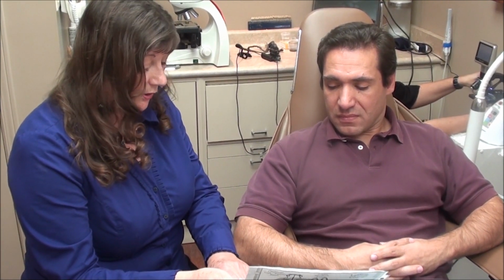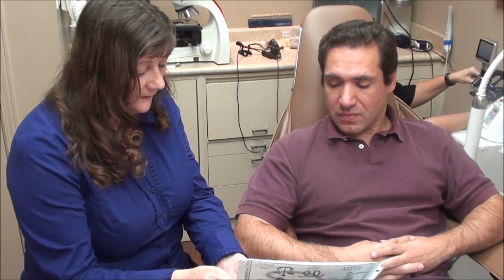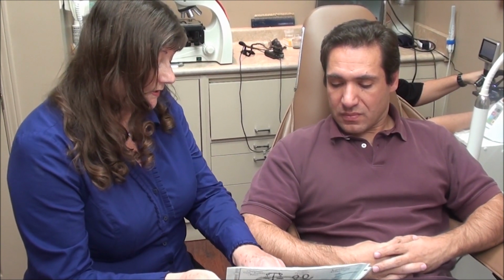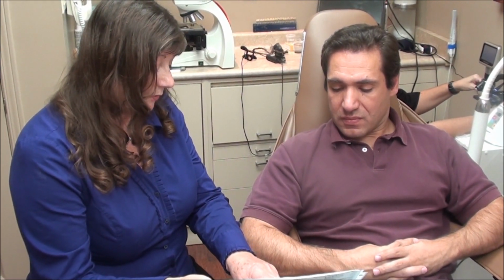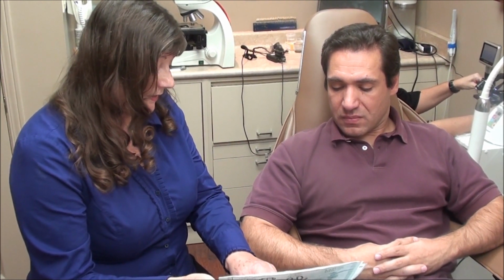This is what the plaque mass looks like. Sometimes there's some red blood cells, there's white blood cells. This is what healthy bacteria looks like, and then we can look at some skin cells as well. Now what we're going to do is look at it and decide on a risk level. When you have the spinning rods and the gliding rods, that is an early risk level of gum disease. When you have the first three, the spinning rods, the gliding rods, and the spirochetes, that's a medium risk level. And when you have the amoebas and the trichomonads, that's a high risk level.